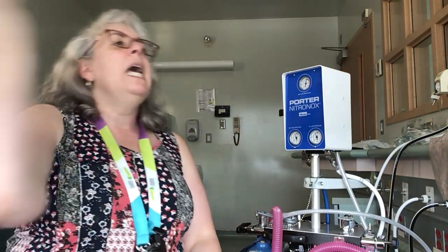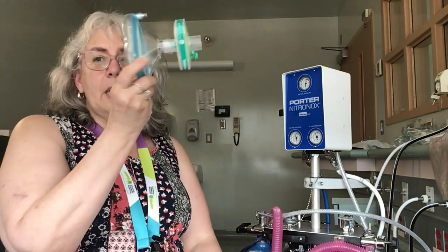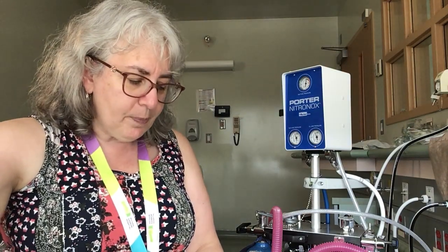Sometimes patients feel claustrophobic, where they don't really like the mask on their face, but what we don't want is breathing in and then blowing out into the environment. Dry mouth, perioral tingling, throat irritation, we can offer ice chips or sips of water. If they're drowsy or dizzy or disoriented, they can stop use for a bit and then reinstate use. Nausea and vomiting, they can stop use for a while, and then when the feelings subside, they can reinstate the use if they like.